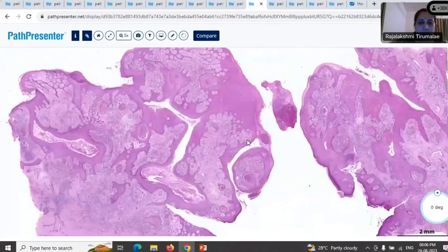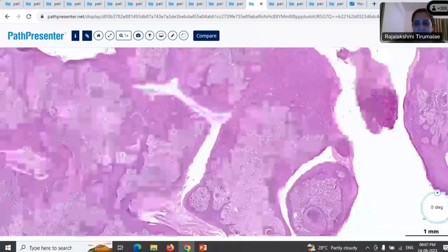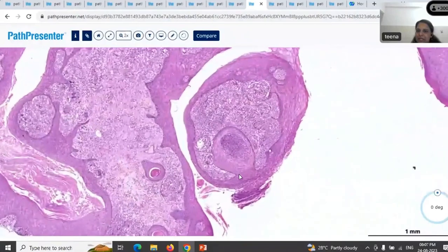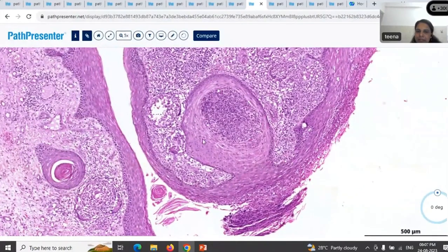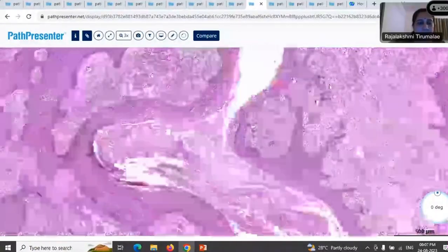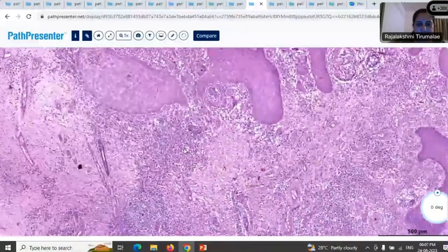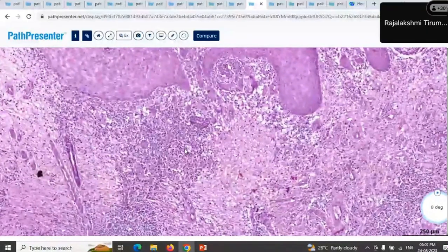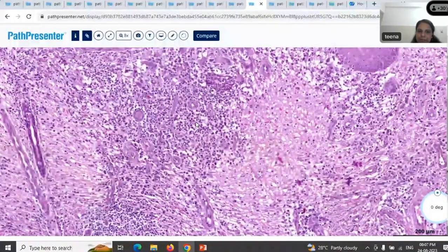And like you rightly said, what are the epidermal changes? Pseudoepitheliomatous hyperplasia. Okay. And there's something else that you described? Neutrophil collection within the epidermis. Yes, very good. Now, can you tell me what this dermal infiltrate is made of? Predominantly, ma'am, neutrophils. What are the cells that you're seeing in the infiltrate?